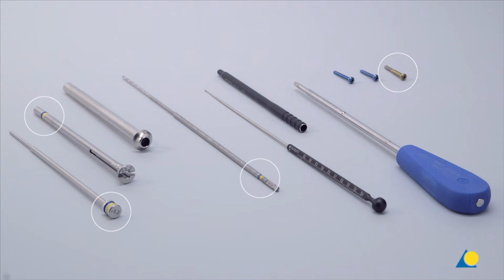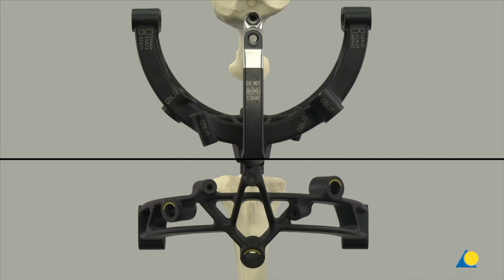The gold cancellous bone locking screw is only used in combination with the two oblique proximal locking holes in the aiming arm, labelled Oblique 1 and Oblique 2, or the AP proximal locking hole. The aiming arm can be used to target all three oblique locking options. The oblique locking option labelled Oblique 1 corresponds to the most proximal locking position. Inserting an end cap with this locking screw will create a fixed angle construct. This is the option demonstrated in this exercise.